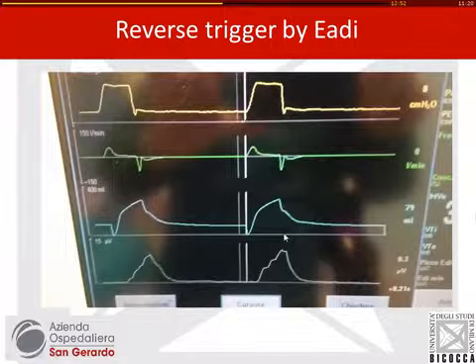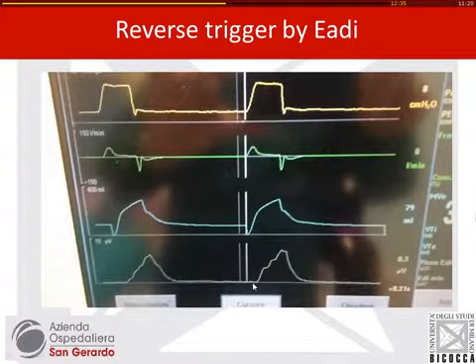the ICU, and on our own patient, this patient was on ECMO, we've seen this. We have the NAVA catheter in, it's something we do quite routinely in our patients undergoing ECMO, and as you see, this is a clear reverse triggering. Here the ventilator starts on the yellow line, and much later the patient is activating the diaphragm to somehow move away. And here it's exactly the same. There is no line, but if you pull a line down here, you see that the ventilator comes first, and then the patient comes.